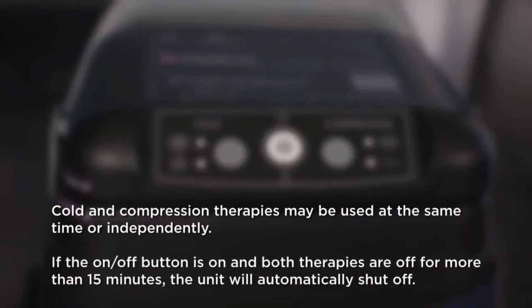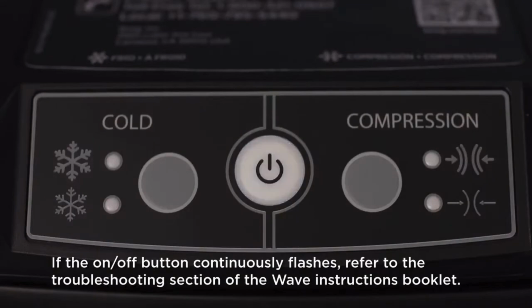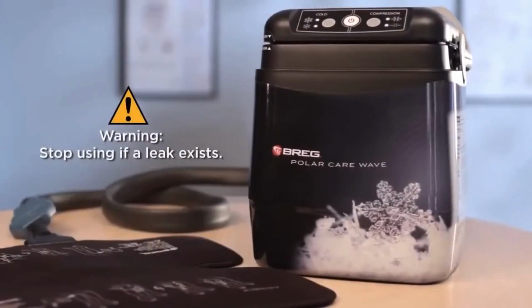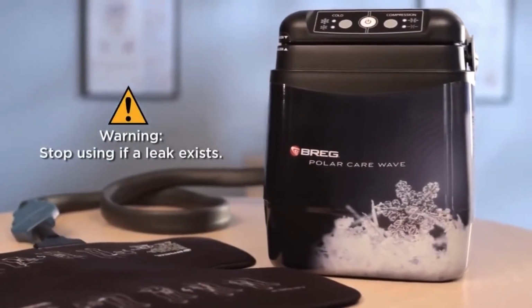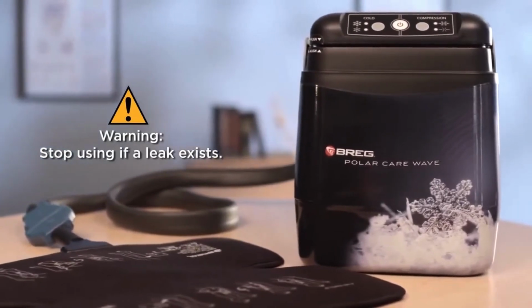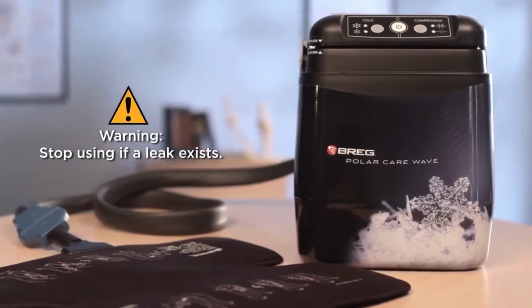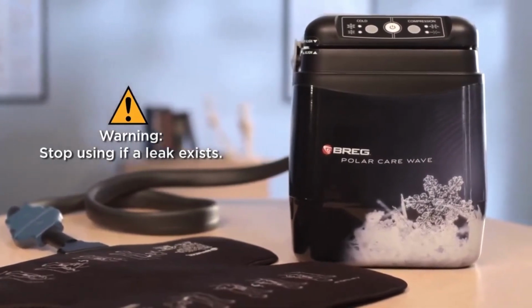If the on-off button is on and both therapies are off for more than 15 minutes, the unit will automatically shut off. If the on-off button continuously flashes, refer to the troubleshooting section of the Wave instructions booklet. If you notice there is water leaking from any part of the unit, pad, or connection, beyond normal dripping associated with disconnecting the pad, unit, or condensation, please stop using the unit and contact your local BREG sales representative.